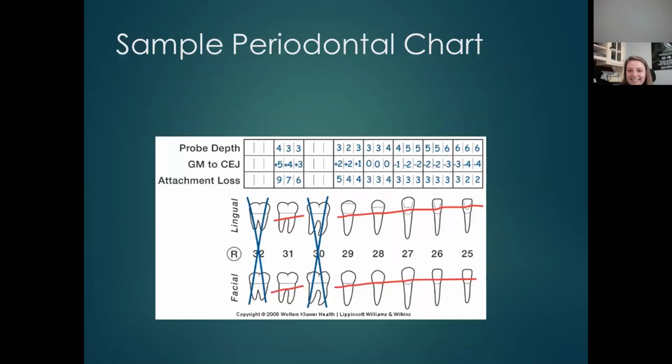And this is the same picture that we saw earlier. Now look at where the gingival margin is. They are saying there's 1 and 2 millimeters overgrowth. And look at this, number 25, there's 4 millimeters of gingival overgrowth. There was a 6 millimeter defect. Okay, they probed 6 millimeters. There's 4 millimeters of gingival overgrowth. You subtract the two, so the CAL is 2 millimeters.